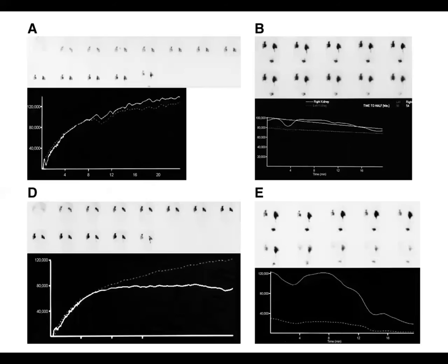Here on this slide, again, we can see the pairs of the scintigraphic presentation. This is morphofunctional imaging of the kidneys, right kidney, left kidney. And we can see the graphical presentation of the radiopharmaceutical. From here we can see the solid line, it's one kidney, dashed line, the second kidney, and we can see that this is, as you may guess, the obstructive type of the curve.